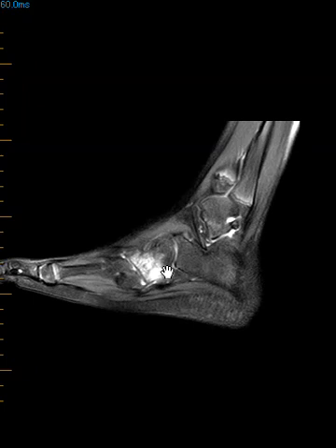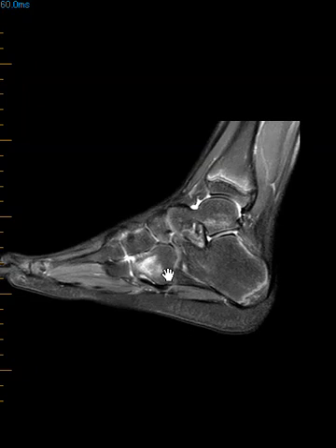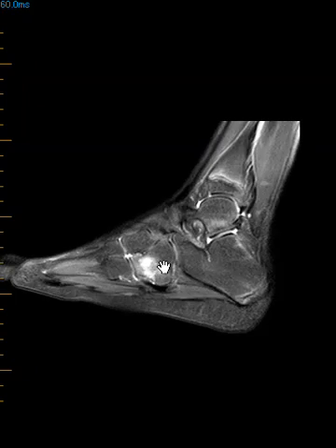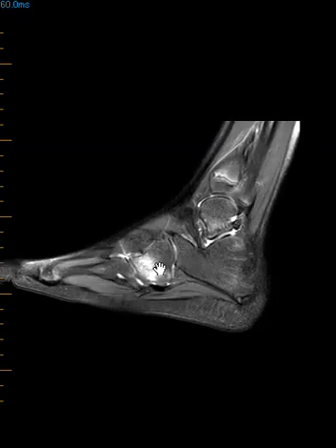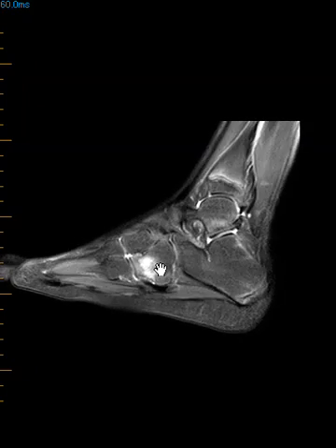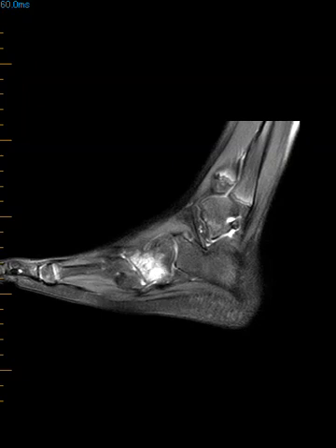This is the cuboid bone, and on this view anything bright is abnormal. This is marrow edema within a non-displaced cuboid fracture. When they're non-displaced, they're very hard to see on x-rays — sometimes you can't see them at all unless you have just the right alignment to look down the barrel of the fracture line. On the prior images you really couldn't quite see it, but this shows it more clearly — lots of brightness right here in the cuboid bone.